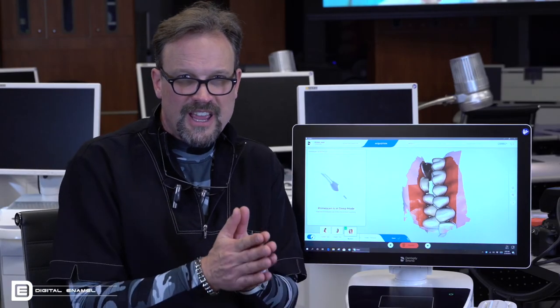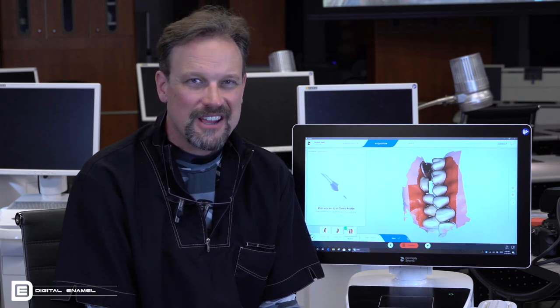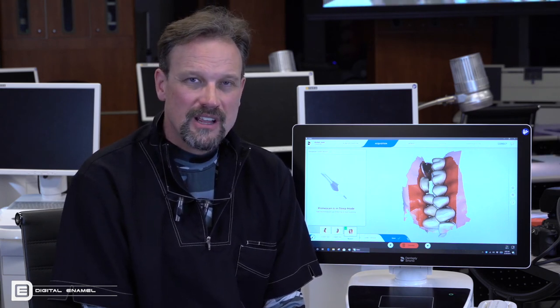Your PrimeScan is an unbelievable tool. It is super fast. Don't push it to its limits. In fact, don't push any dental scanner to its limits. You don't need to. You saw how little imaging I needed to do just for one restoration. This goes with multiple units as well. Your goal, I believe, is better data, not faster data.